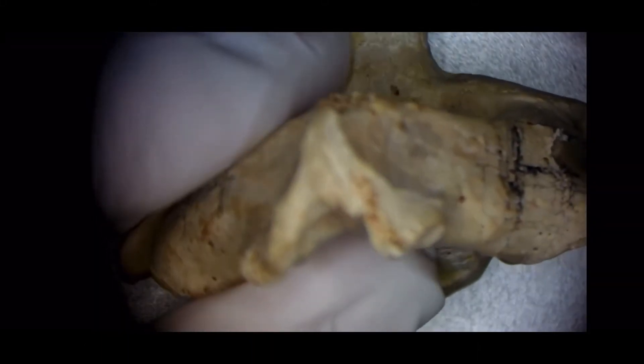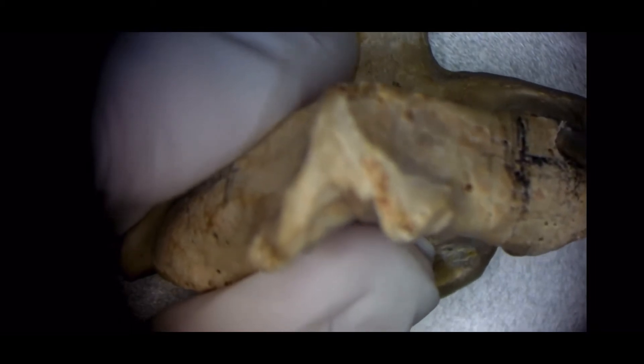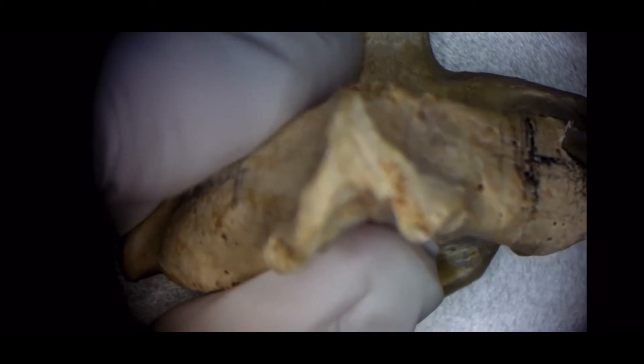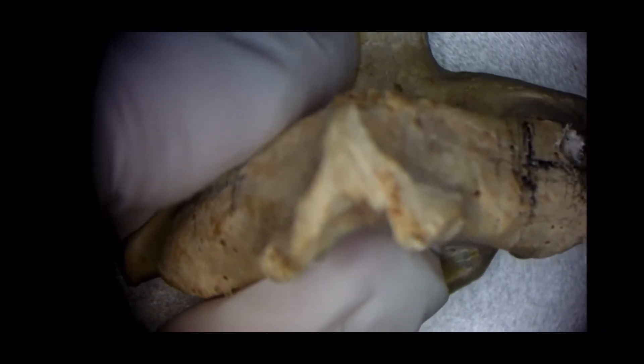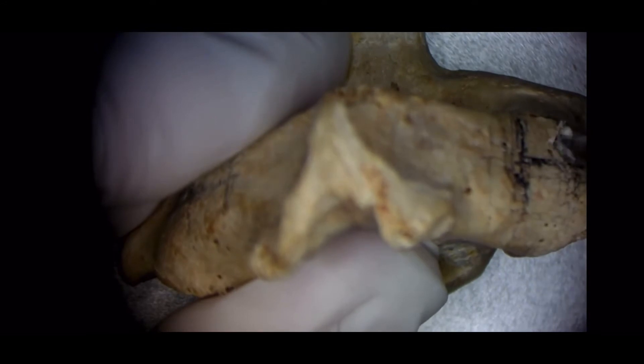I am Dr. Mushiraman and today I am going to show you how to put a transpedicular screw in a cervical vertebra.